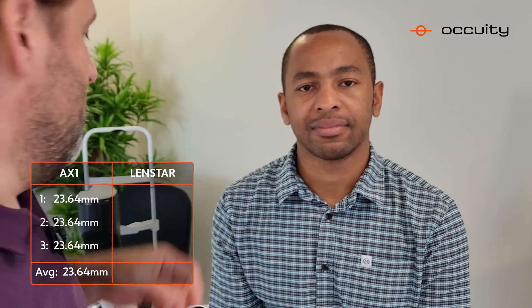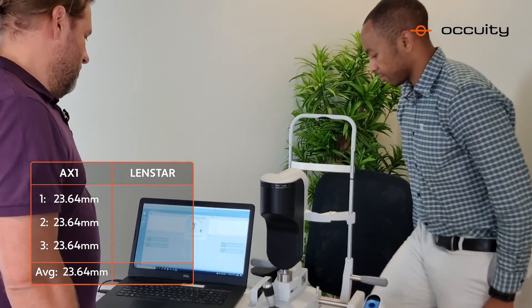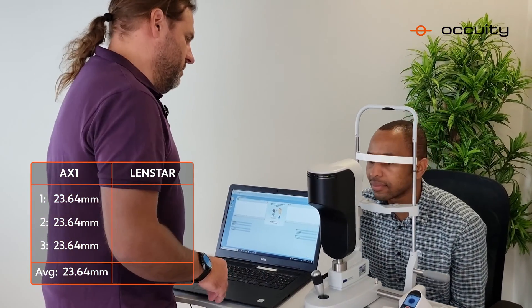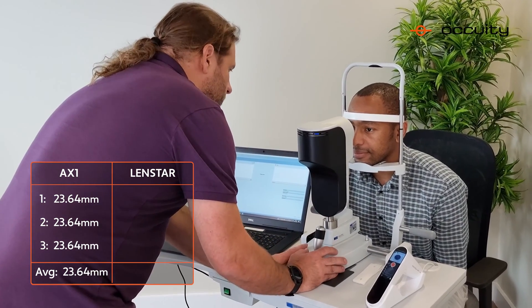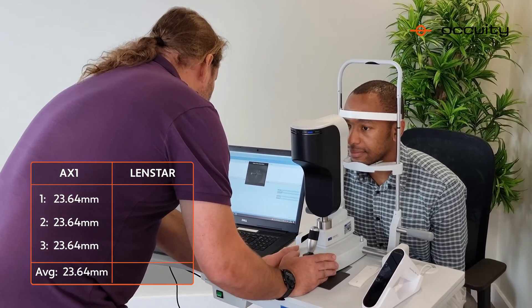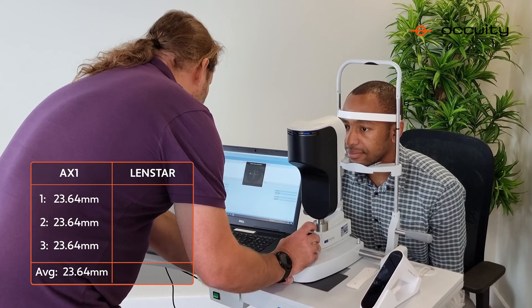I'll now do a comparative measurement on the Lensstar. Michael, if you'd like to take a seat. The Lensstar is a larger desktop device with a chin rest. Michael, if you'd like to put your head in and get comfortable. I'm going to align the device to your eye. If you could stare at the red dot and hold as still as possible.